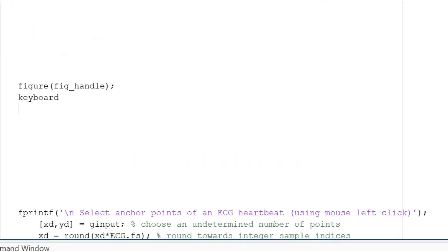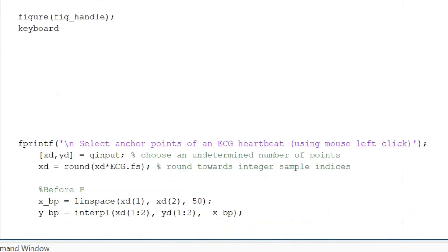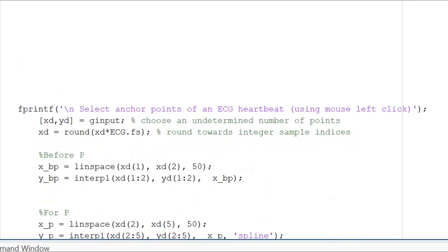Next, we will select the anchor points of the ECG curve that we need using the mouse left click. Now these points can be gathered using a function called ginput.